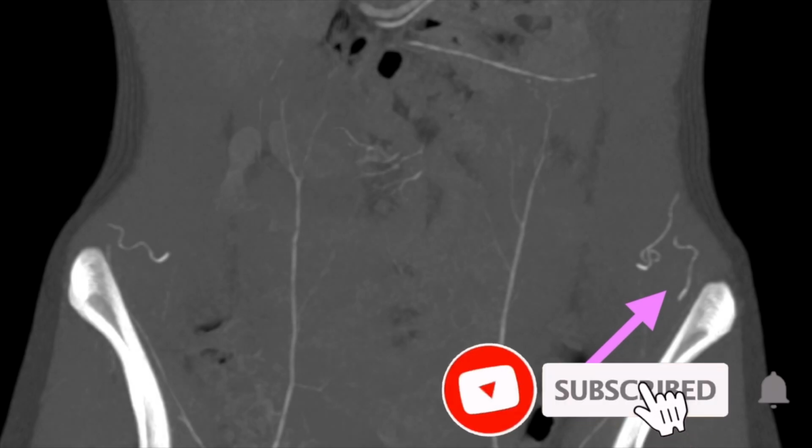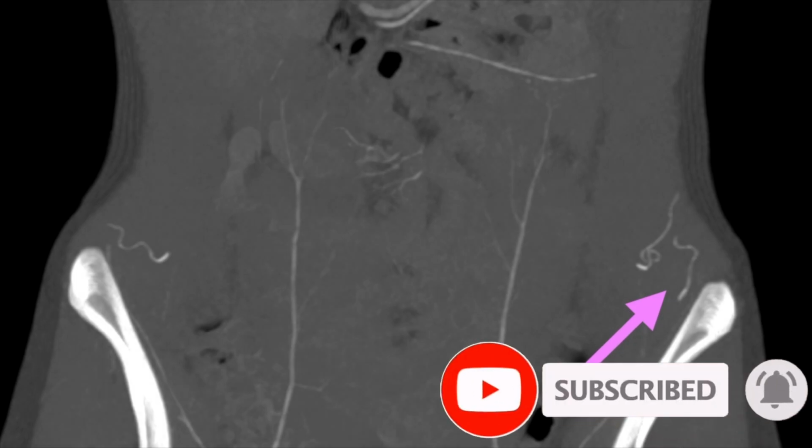You now know a lot about ilioinguinal nerve stimulators and the ilioinguinal nerve itself.